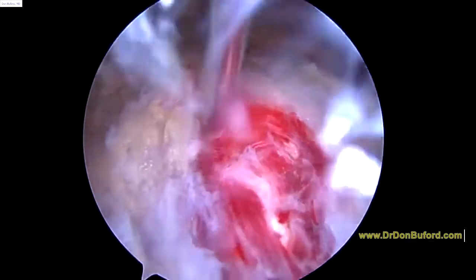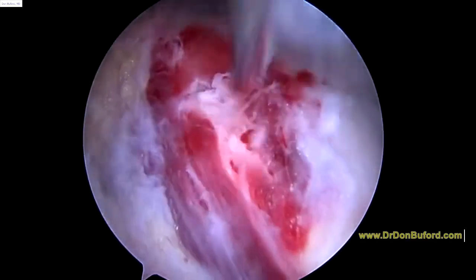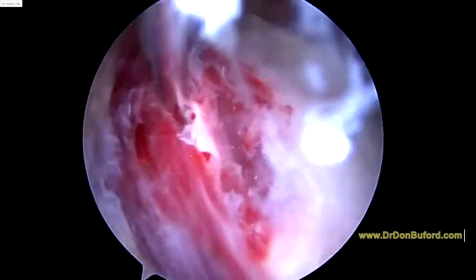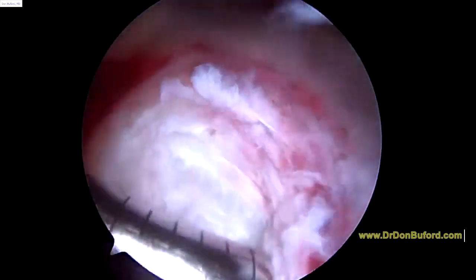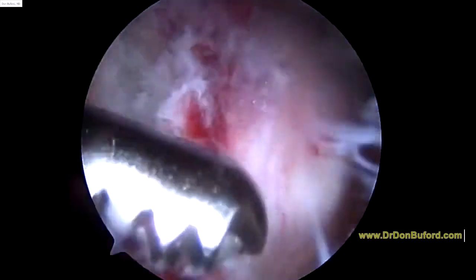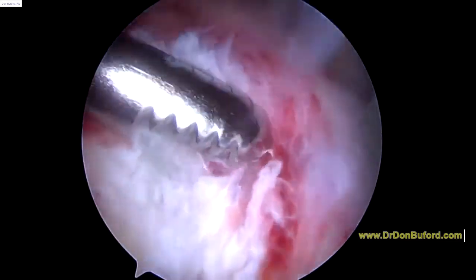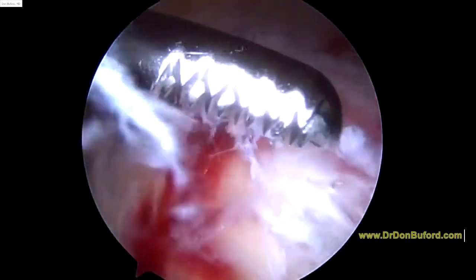This is exactly where the calcium deposit is. We'll debride this a little bit because clearly it's still causing some inflammation. We'll debride that last little bit of remaining calcium. I don't think we have to put an anchor in. Let me just show you the rest of the cuff — here's the cuff along here. I don't really want to debride any healthy tendon if I can avoid it.